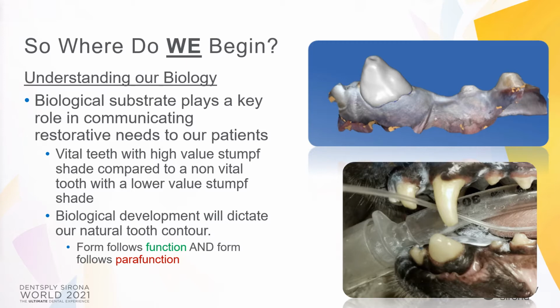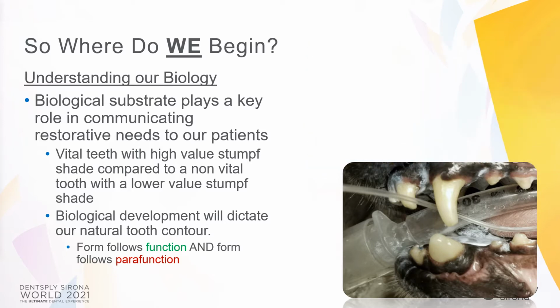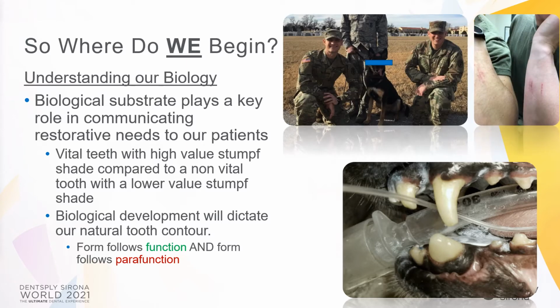Obviously, that doesn't just hold true for our patients that are human beings. You can see in veterinary dentistry with this CAD/CAM we did here, the biological development and what that tooth's purpose is dictates its final form. Now you're probably asking yourself, can a CAD/CAM restoration hold up in a dog?